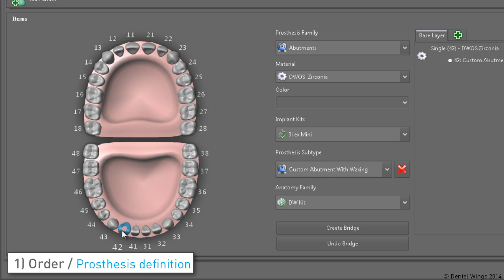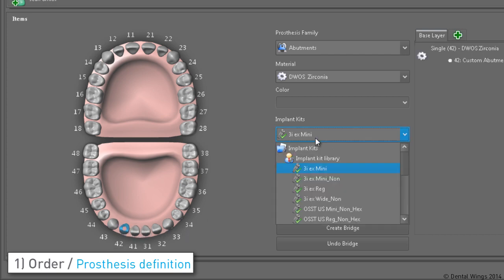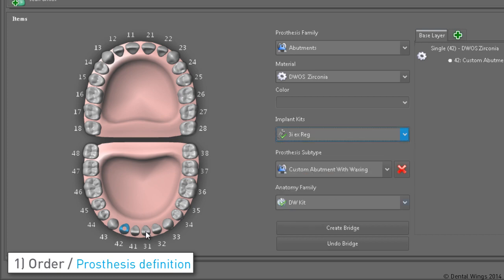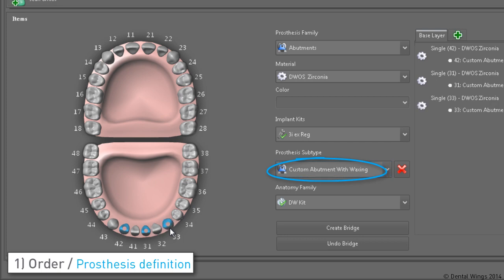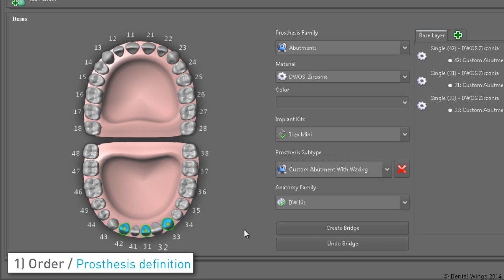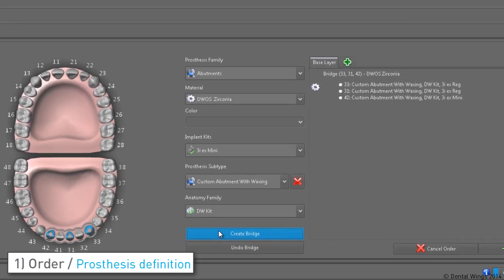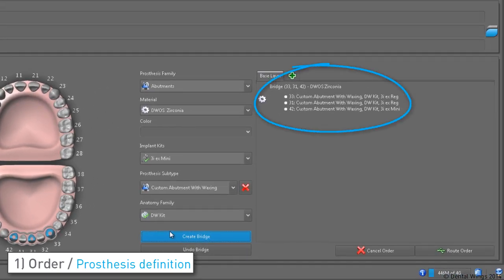Click on the corresponding tooth number and repeat the previous steps for each implant definition. The prosthesis type menu must always be set to custom abutment with waxing. Then reselect all three implants and click on the create bridge button. Verify the bridge definition and route.